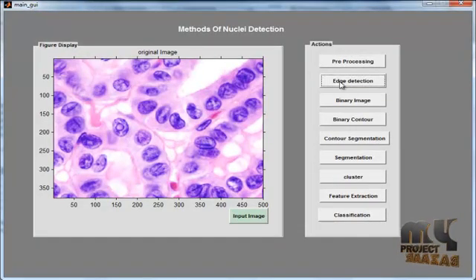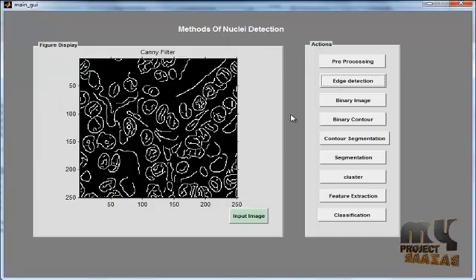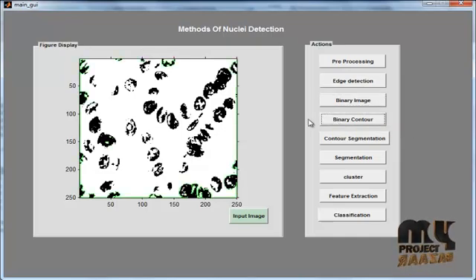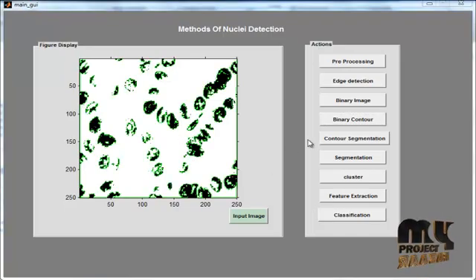Then click Edge Detection. After clicking edge detection, the edge is detected using the Canny edge detection method. Then convert the image into a binary image by clicking the Push Button Binary Image. After clicking the binary image button, we can see the image as a binary image — the black areas are represented as 0s and the white areas as 1s. Then click the Binary Contour button. After clicking it, contour segmentation is applied to the binary image and the contour segmentation result is available.